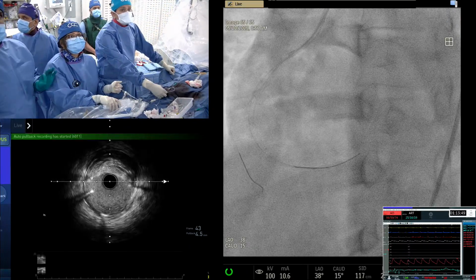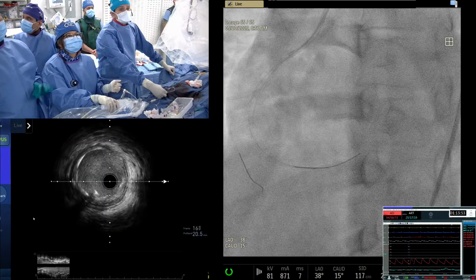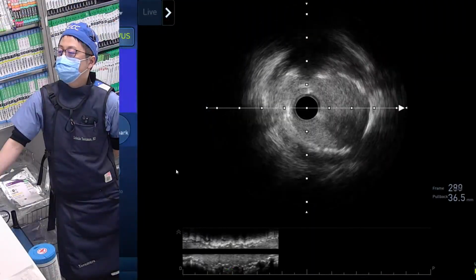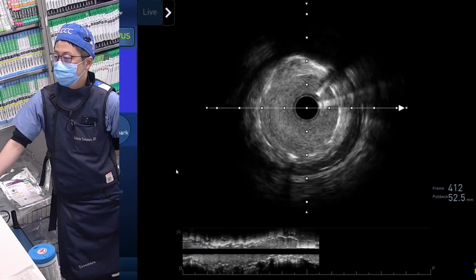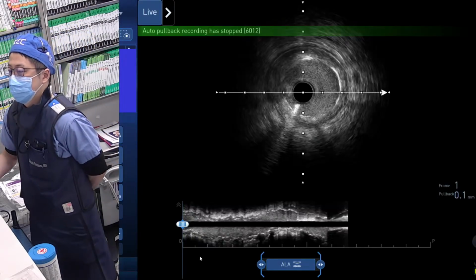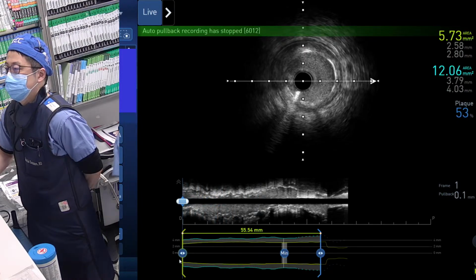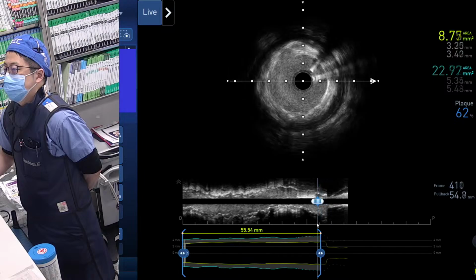Yeah, it's an edge. Good transition. Yeah, we're expanding the stent. We did 3.5 post-dilatation. Yeah, I see the side branch. Come to the proximal. Nice, expanded. Lumen, yep. Came into the guide. You want to squeeze a little more proximally? We did 3.5, we went up to 20. What more do you want? No, but proximal, you tell us what's the MSA before we take out?